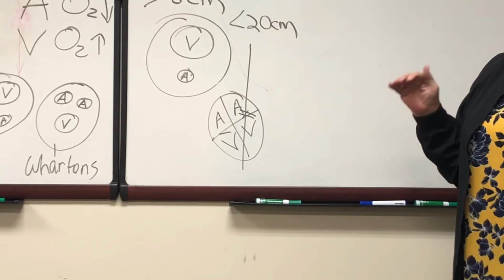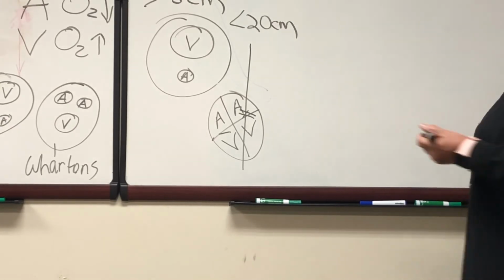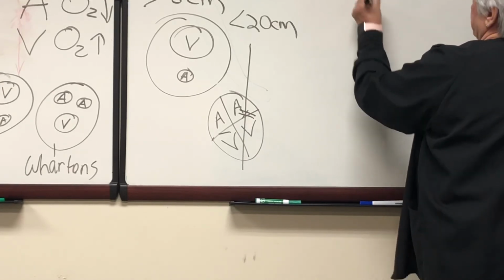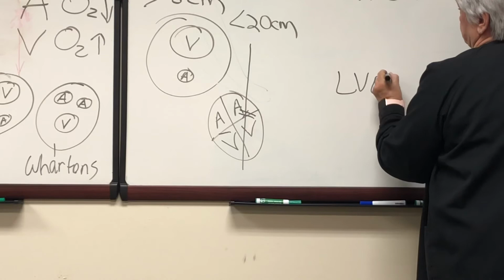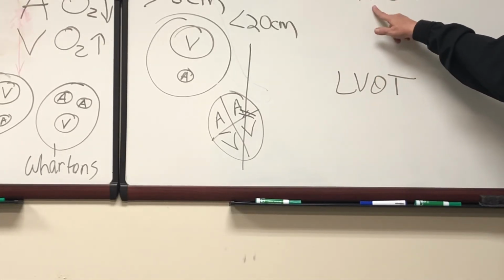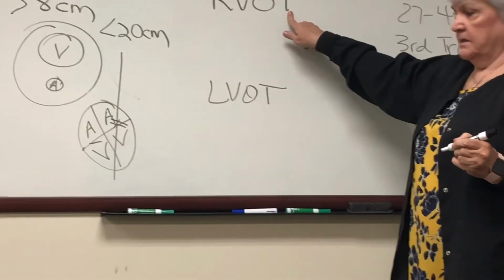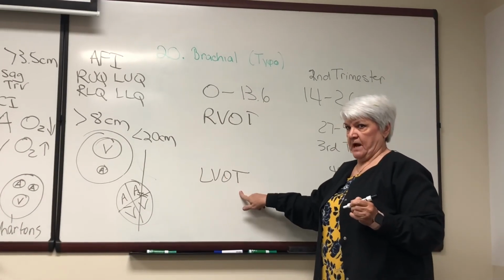Later on, you're gonna have to learn how to do RVOT and LVOT. Okay? Right ventricular outflow tract. Left ventricular outflow tract.